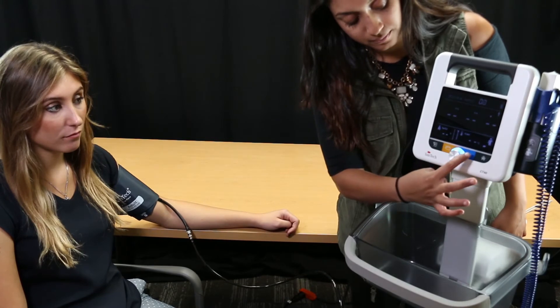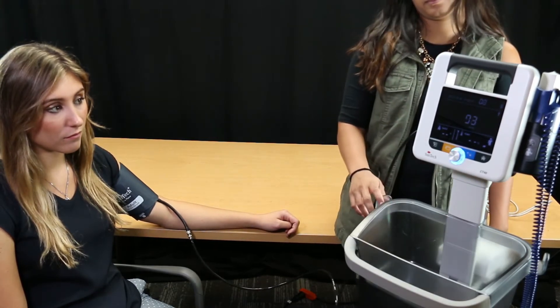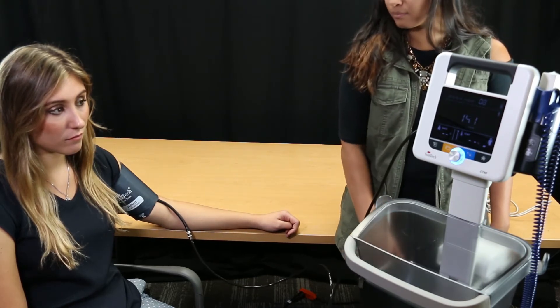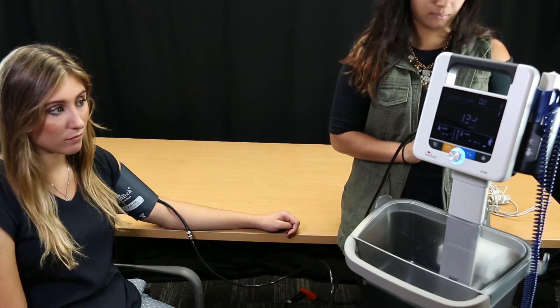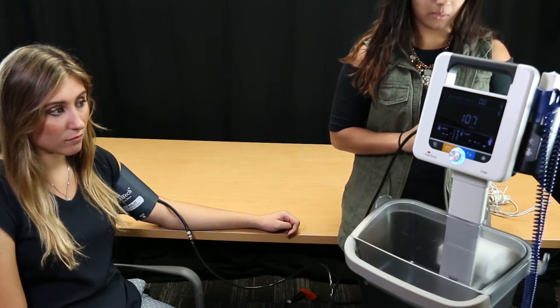Then press the start stop button. The inflate-deflate cycle proceeds automatically until results are displayed on the screen. A long beep will indicate measurement is complete. If needed, press the start stop button to stop a BP measurement in progress.